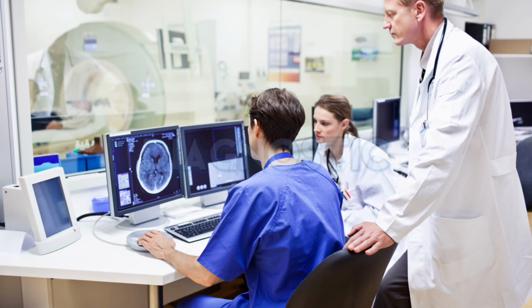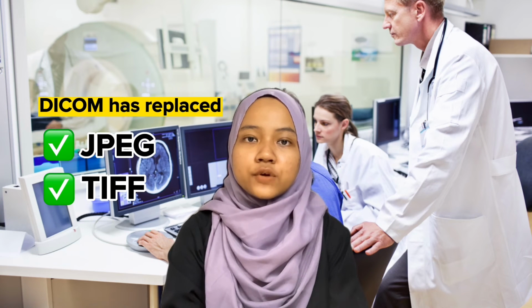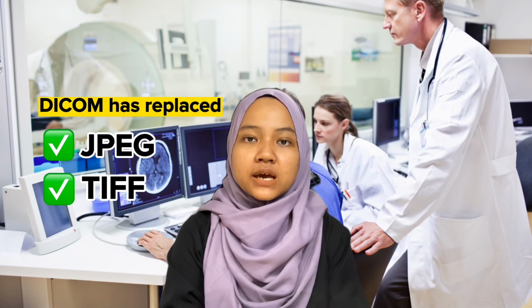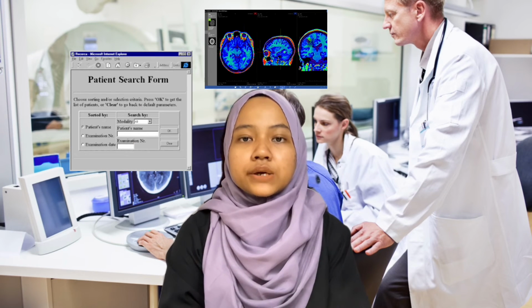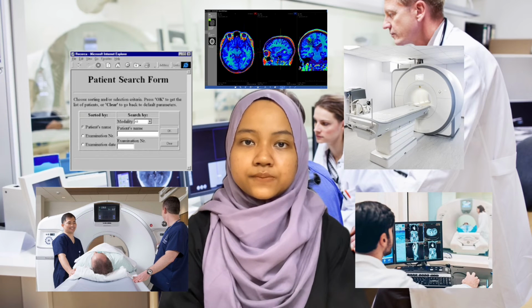Then diagnostics. Dicom has replaced JPEG and TIFF, which are traditional image standards that do not provide patient and procedure information, so they are not useful for diagnostic purposes. Instead, Dicom datasets contain valuable information about the patient, the examination, the equipment used, the medical practitioners and equipment operators involved, and also the scope of the examination.